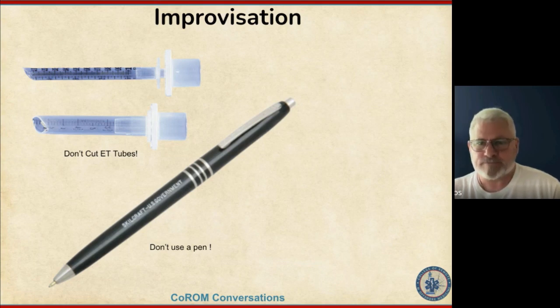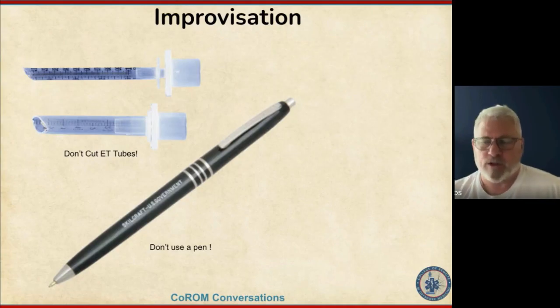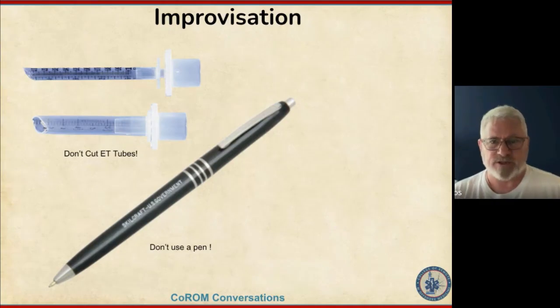They're also not going to be cuffed unless you separate the connecting tube that goes from the plunger end to where the bag is. All of those things are components to doing this. But yeah, these two are perfect examples of what not to do.